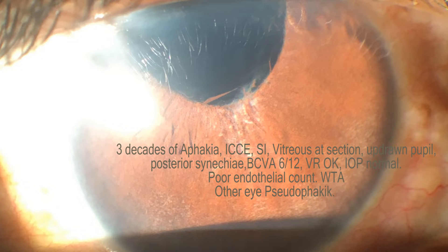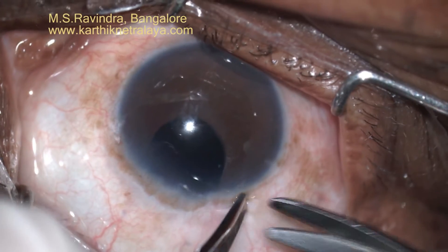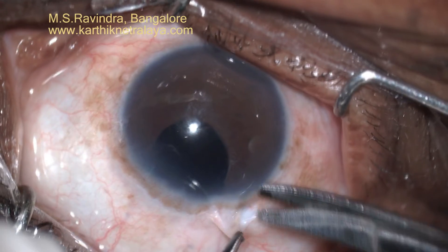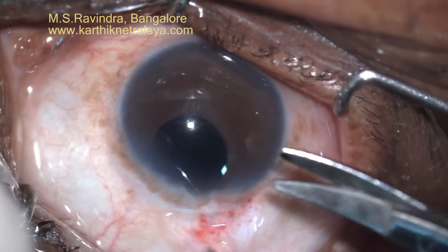Three decades ago this eye had undergone an intracapsular cataract extraction. There was probably a vitreous loss during surgery. The surgeon had done a sector iridectomy and vitreous was found at the section on slit lamp examination.